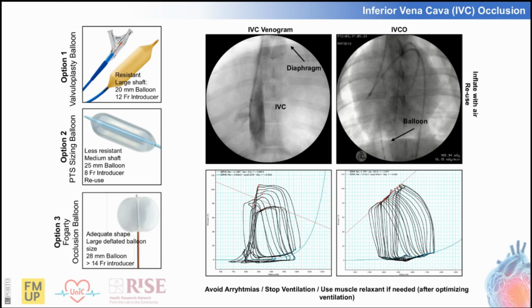When occluding the IVC, some arrhythmias can occur, and in this case, catheter positioning might be the issue, as decreasing the size of the cavity might lead to the catheter being pushed too far into the wall. Other times, when performing an occlusion, the pressure sensor touches the LV wall, which can lead to overestimation of end-systolic pressures. Ideally, always perform the occlusion with ventilation stopped, as you saw in the video, to avoid any breathing artifacts. If the animal is attempting to breathe spontaneously and you are sure that all the ventilatory parameters are optimal, one can consider a muscle relaxant such as rocuronium.